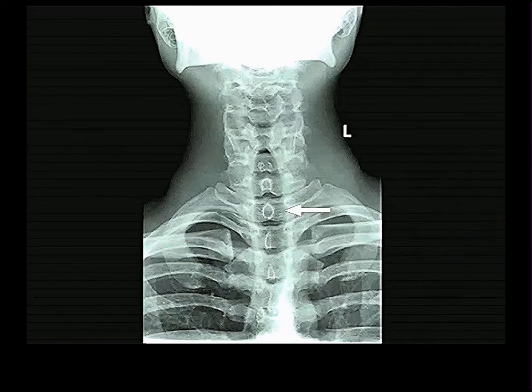But mainly what I see here is this radiolucency, which is what? No, the vertebral canal is filled with a water density structure. Radiolucency. What's the most radiolucent thing on Earth? Air. That's what that is. That is the trachea here, and see, it's narrow right there, and then gets wider above that.